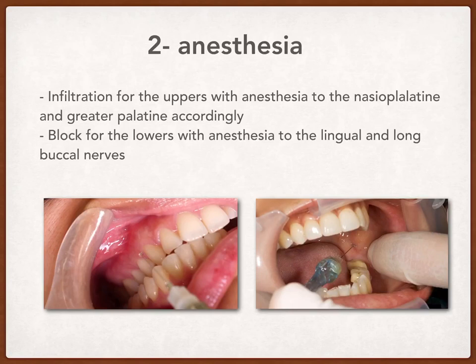If you palpate it, you will notice it, and the right infiltration for the upper first, second, and third molars should be behind this piece of the zygomatic bone, except for the mesiobuccal root of the maxillary first molar that should be infiltrated in the upper second premolar area.